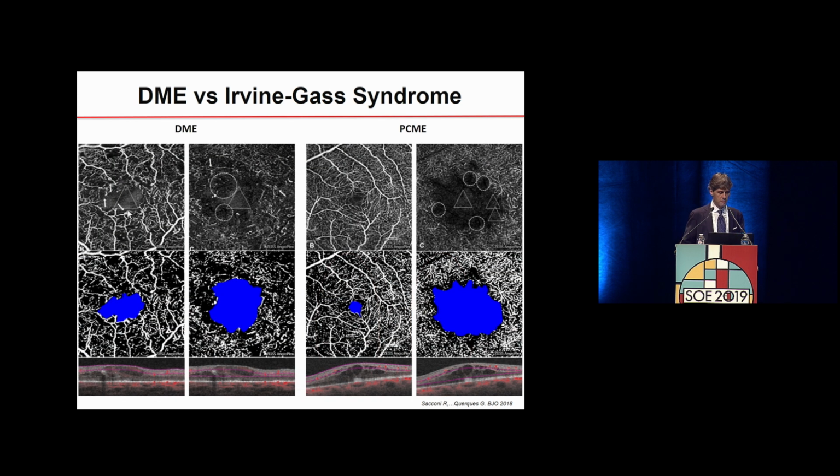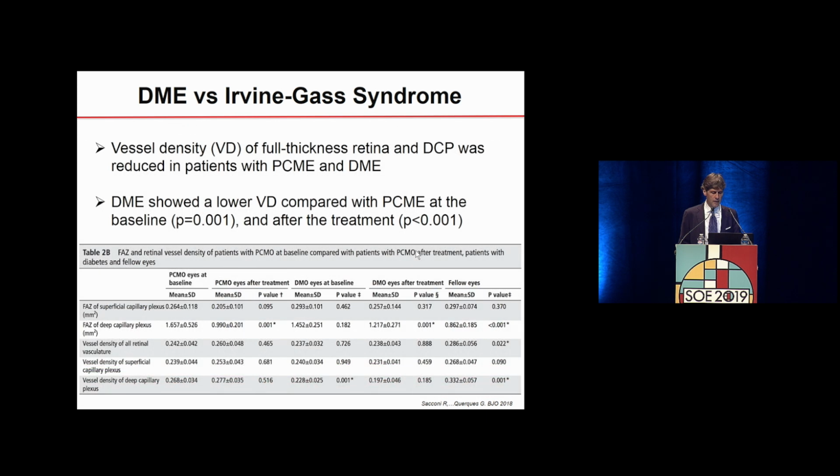This is just to show you some examples. So these are the microvascular changes that were qualitatively analyzed by two readers, and this was in DME, and this is in post-surgical macular edema. So you can nicely see how they are much more frequently detected in DME.